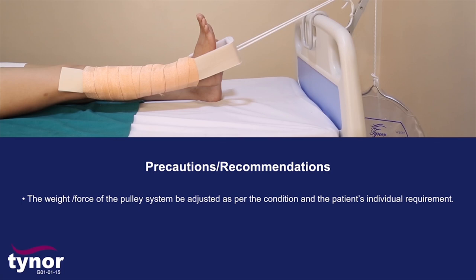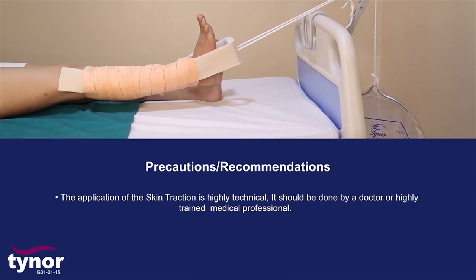The weight force of the pulley system should be adjusted as per the conditions and the patient's individual requirement. The application of the skin traction is highly technical and should be done by a doctor or highly trained medical professional.